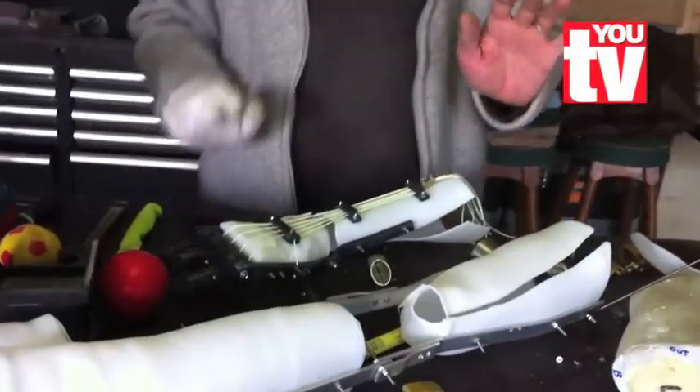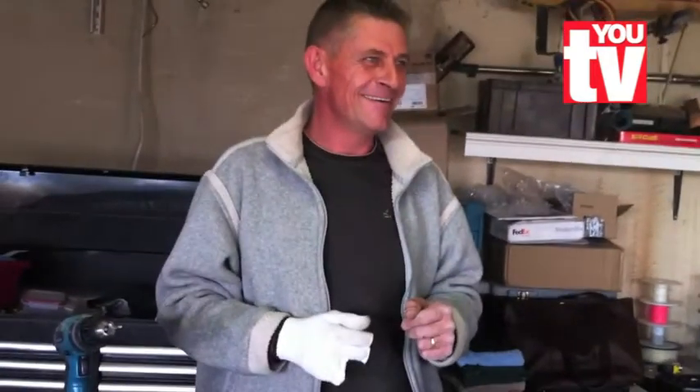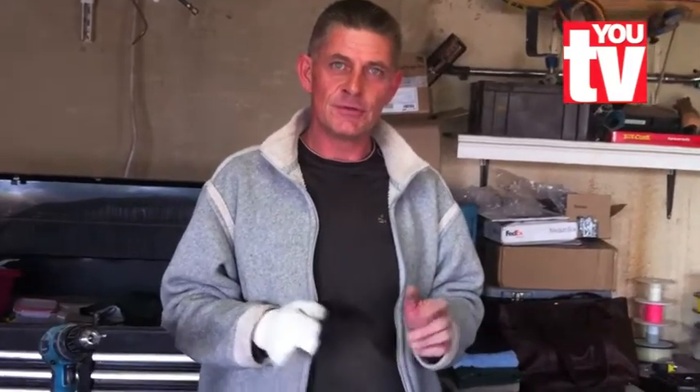At first I thought it would be uncomfortable to be in this position all the time, but it's actually not. Because what happens when you do that? Do you see that? It's open, it's closed. So as soon as you close, do that. So all this is, is just following the anatomy of actually how the hand works.